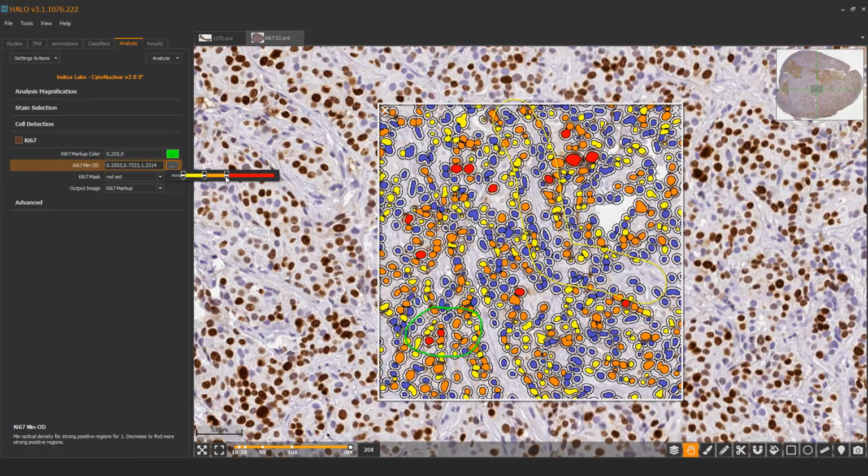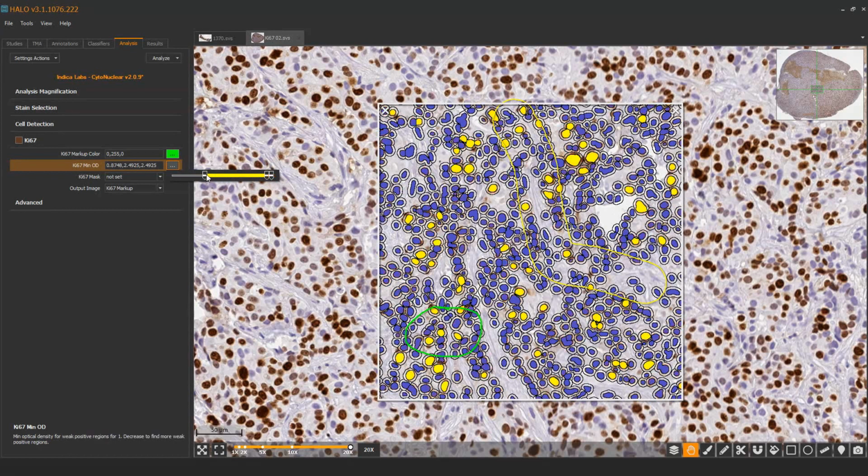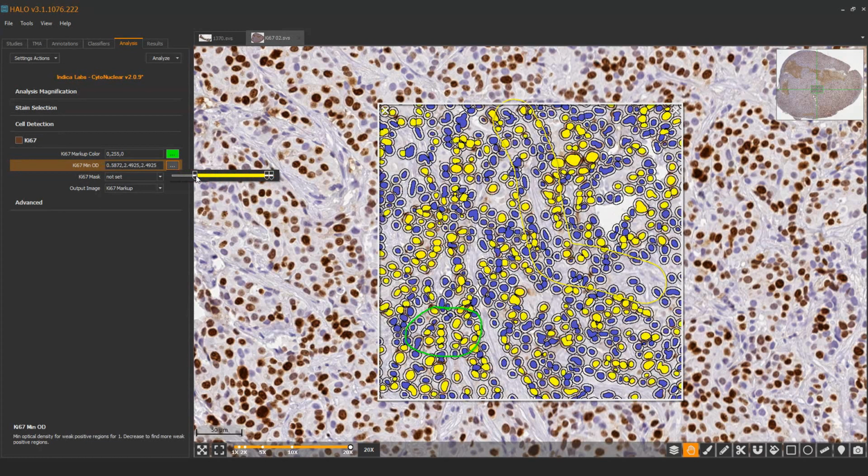Halo will report the number of positive cells as well as the breakdown, so you don't need to do this, which people used to do a lot, just sliding between 1+ and negative. That used to be a trick when Halo was a lot more basic. You used to change the slider just to account for either the stain being present or absent. You don't need to do that anymore.